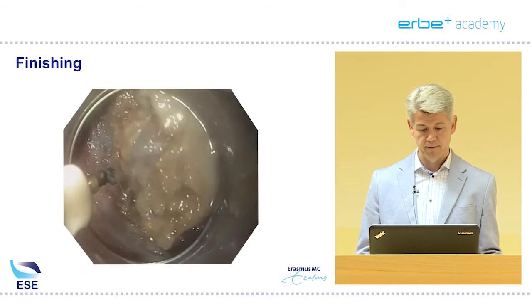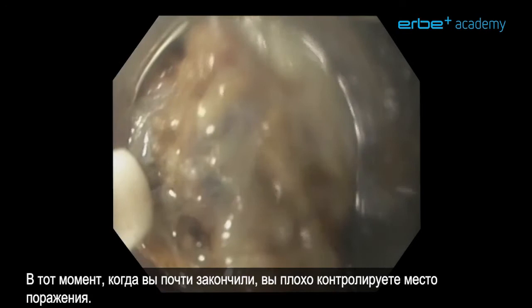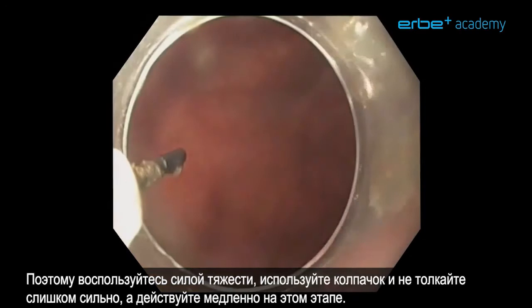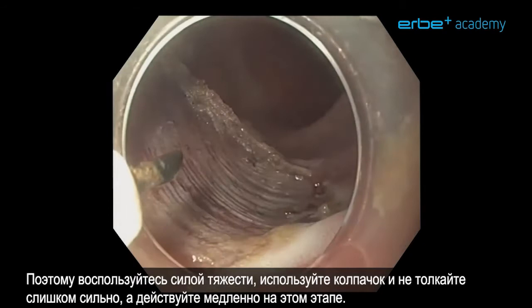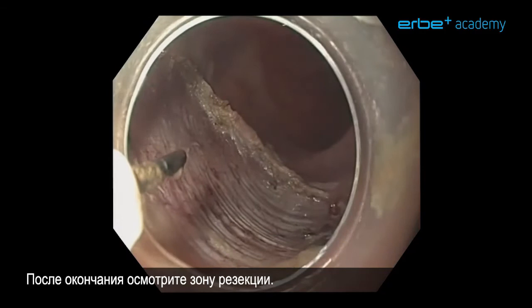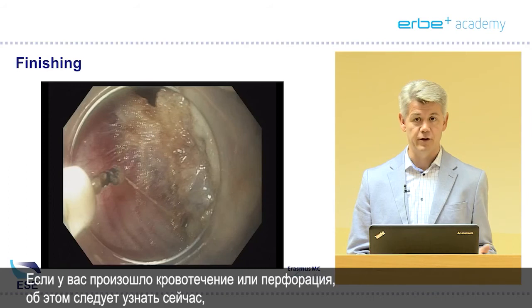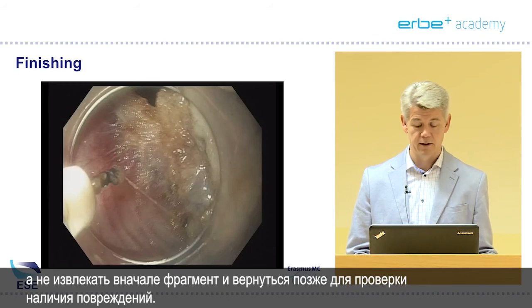Finishing is difficult — by the time you're almost finished, you have poor control of the lesion. It will be floppy and moving everywhere. So make use of gravity, use your cap, but don't push too hard — go slowly. Once you're done, have a look at the resection site first. The lesion will be there and you can retrieve it later, but first look for any signs of trouble. Whenever you have a bleeding or a perforation, you would like to know it now and not come back later to see there is quite some damage.